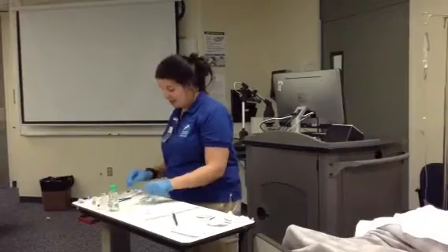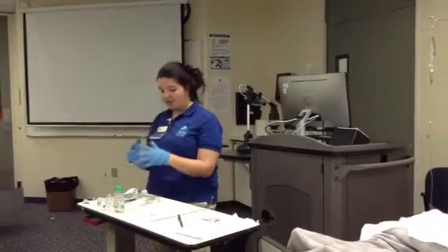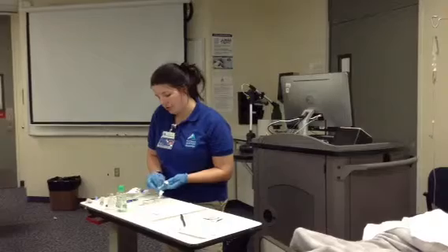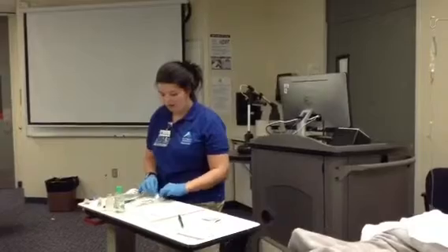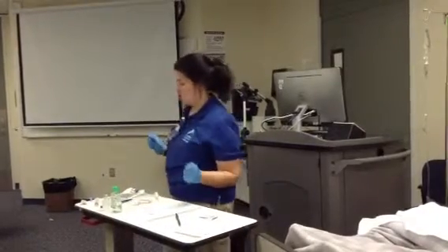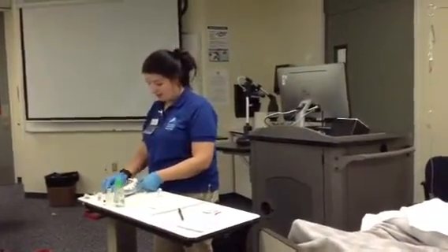Okay, now for my tubing, before I do that, I need to put my label on here. And that's my bag. I've got my client's name, the drug, the dosage, the time, and my initials. Okay, and then I'm going to go ahead and label my tubing. That's got the date, time, and initials on it. Okay, there we go. Another piece of tape on there, but not where it covers up the words, the letters. Okay, and now I've cleaned the top of this, so I'm ready to go ahead and spike my bag.